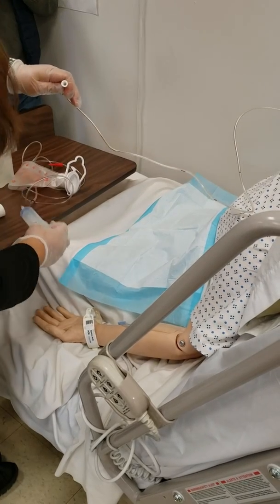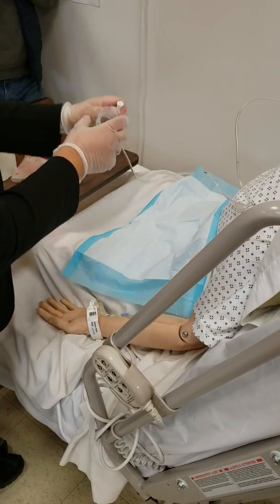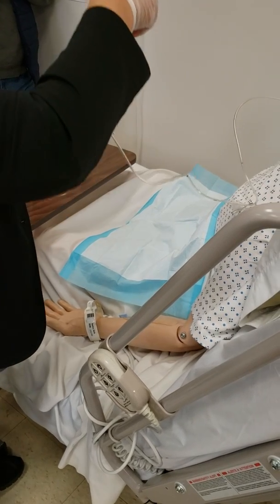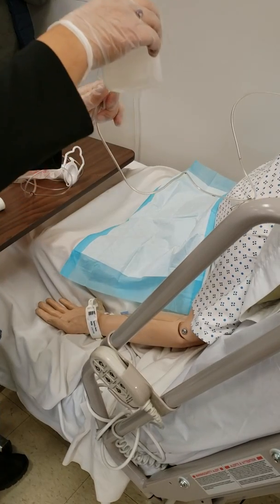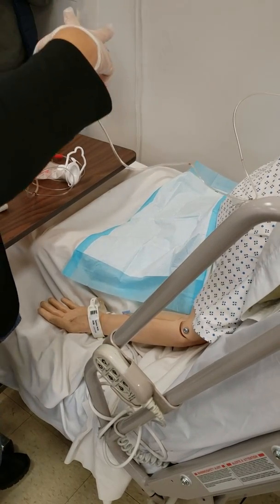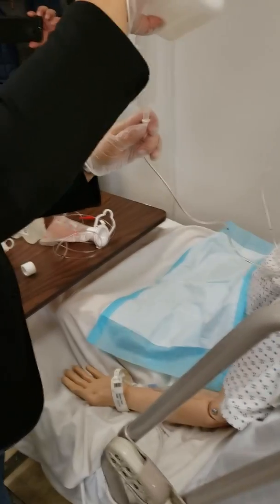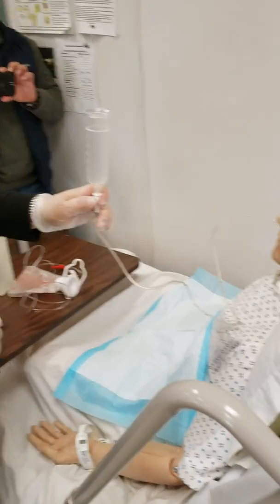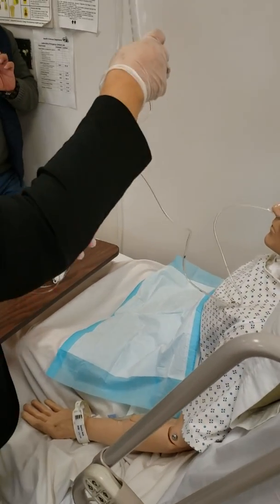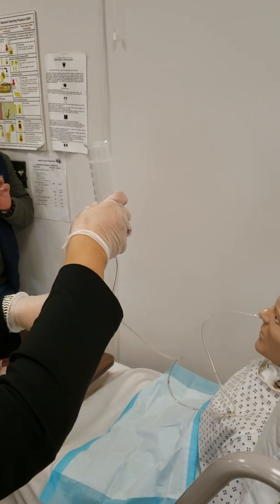Then we will take this out, put this over here, and by gravity we will flush. You have to measure, that's why you have to kink it like this. Put 30 mL of drinking water and allow the water to flush the tubing.